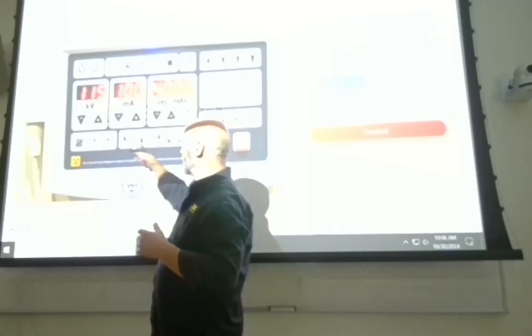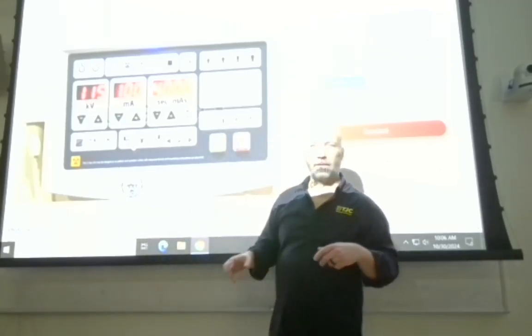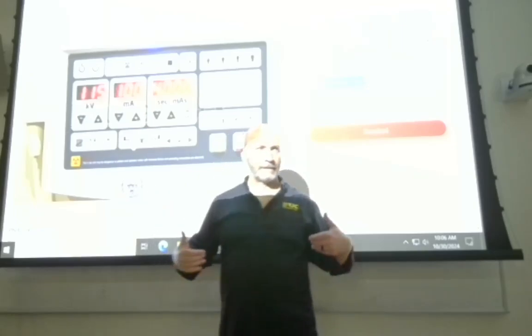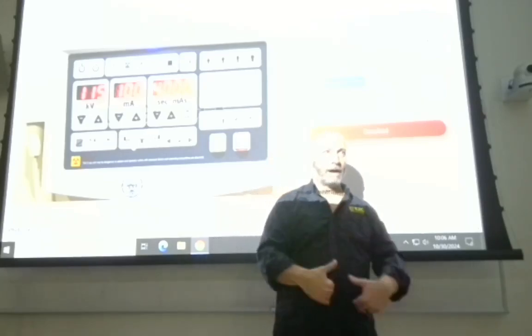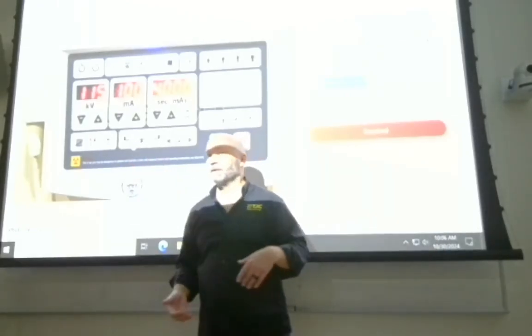What you want to do is put the anatomy of interest directly over the photocell that you're using. Okay, so if you're shooting an AP L spine, where's your L spine? Where should it be? Lower center. Yeah, it should be right at the middle line of your body, right? So naturally, you would want to use that center cell.